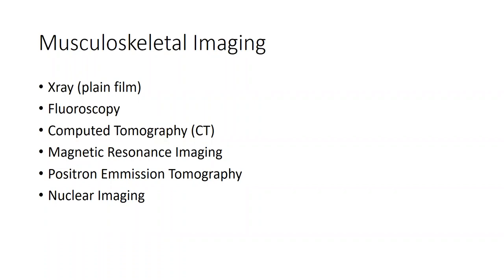I'm a pediatric orthopedist, so when I want to look at a hip that's not bony, I can use an ultrasound, and I can look for a cartilage shadow, and I can actually see if the acetabulum and the femoral head are together. Dynamically, I can put the hip through a range of motion and see if it moves. Okay, so some of these are dynamic and some of them are static.